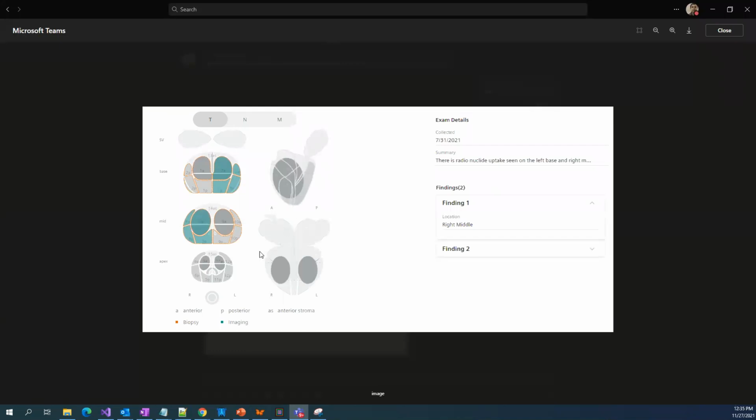So this is how the cartoon would look, the prostate one. I am not yet an expert who can detect where the posterior lateral middle peripheral zone is. Somewhere it says P is this side, and the posterior is here, the anterior is there.